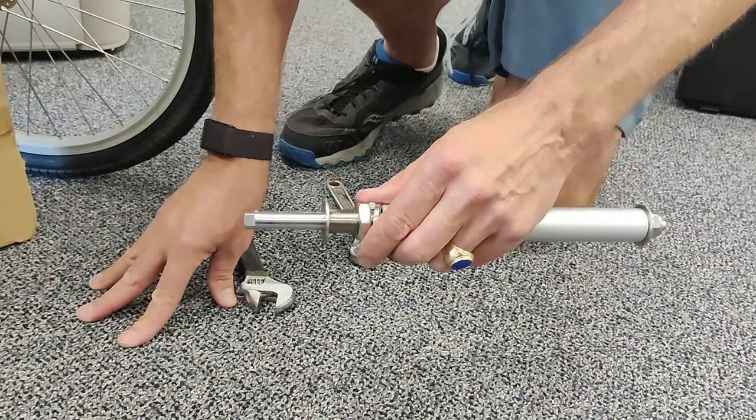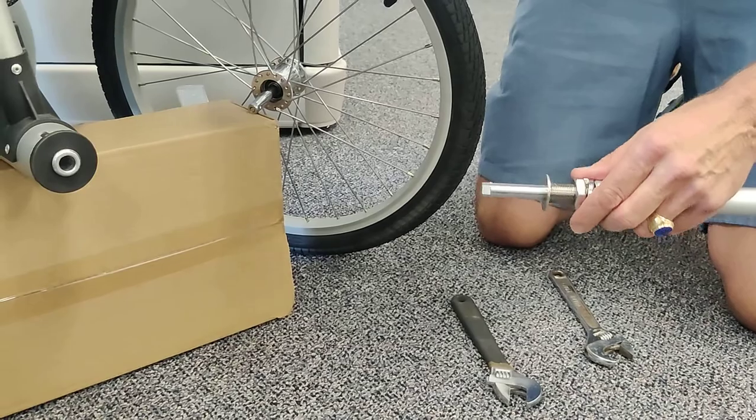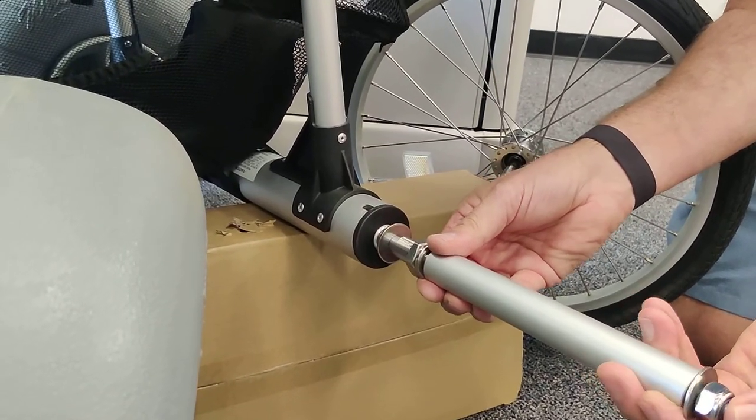Next we'll determine what length we need to adjust this pin to, to match your stock pin, by test fitting it into the socket and pushing it in and listening for the click.